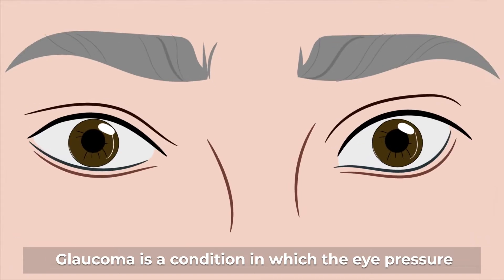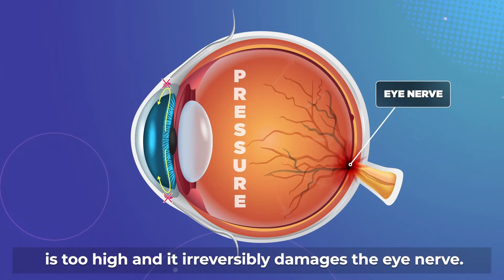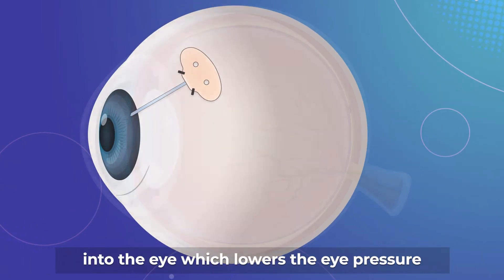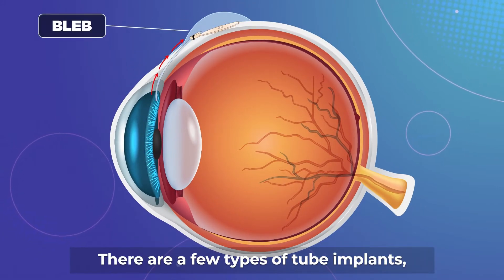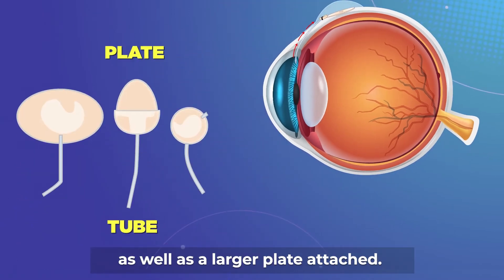Glaucoma is a condition in which the eye pressure is too high and it irreversibly damages the eye nerve. Tube implant surgery involves inserting a device into the eye, which lowers the eye pressure by draining fluid out. There are a few types of tube implants, all of which have a small tube as well as a larger plate attached.